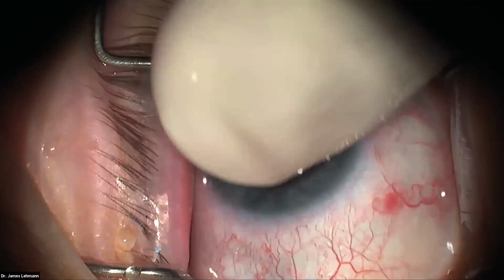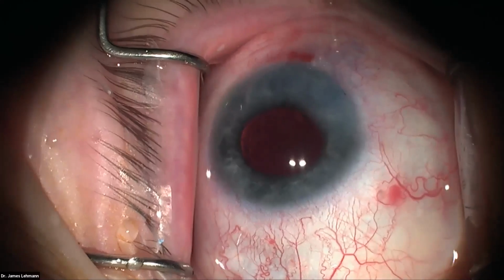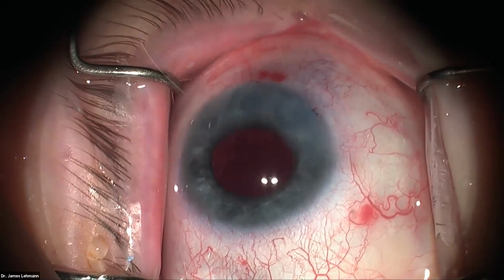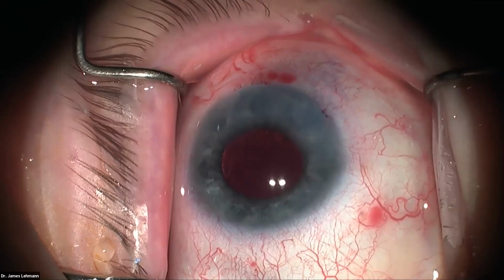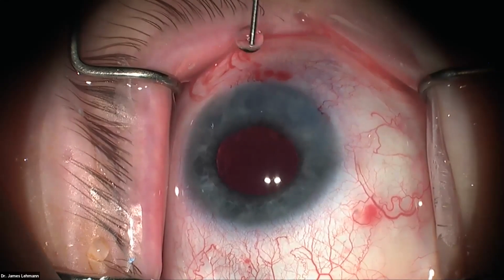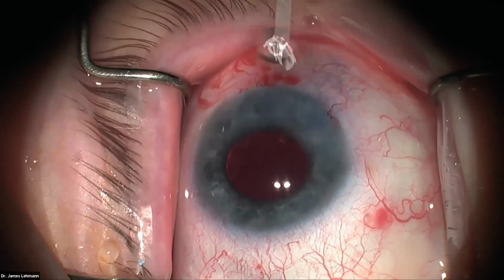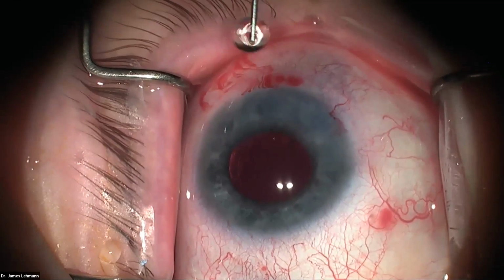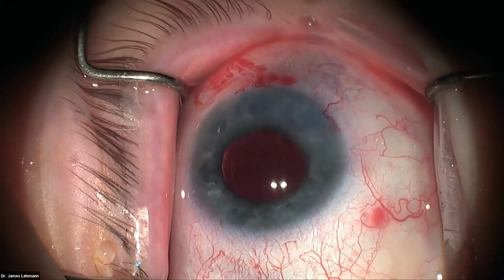And so again, we did this with topical anesthesia. The patient's real relaxed, no sleeping. Everything looks good. The lens is in the bag. There's a little bit of cortical material around the periphery. It's a little tricky to get, so we're going to leave it. That should be fine. And so everything's going well. I'll turn it back over to Hunter, and then I'll join y'all again here in a second when I do the lecture, okay? Thank you very much.